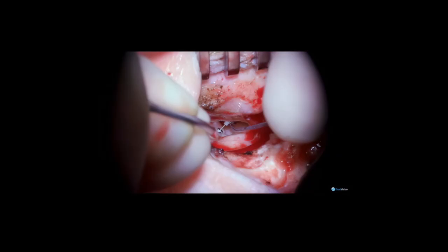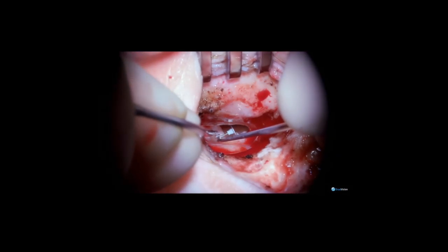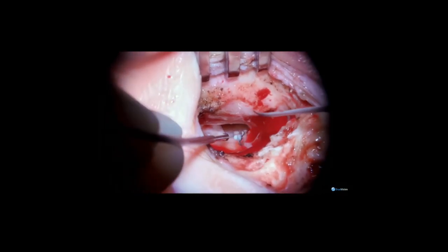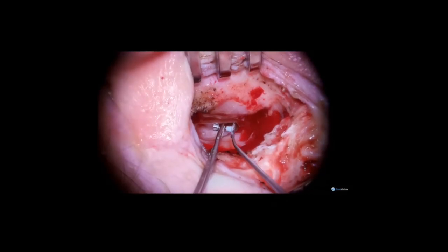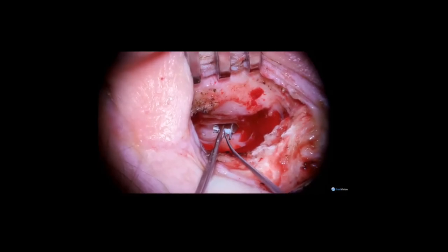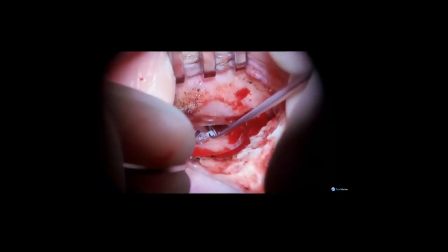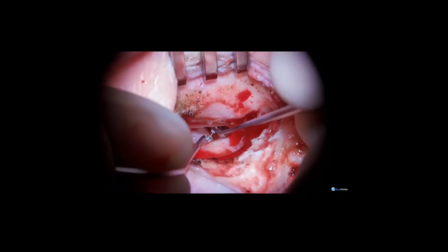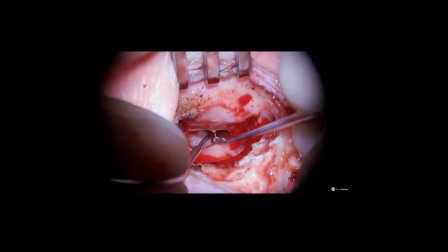Titanium is a very biocompatible material, so it is very useful and safe. I'm adjusting and feeling in this case that the tension is a little too hard, so I will shorten the prosthesis just a bit more to get it into proper alignment and position. I will trim it down to a slightly smaller size. I always try to make it just a little bigger initially, check the tension, and then reduce it to the optimal size and safe placement.